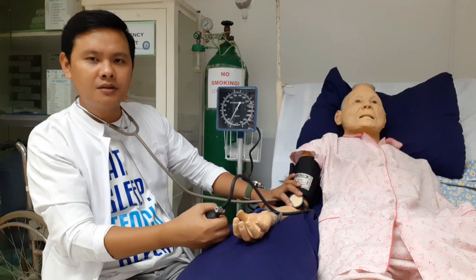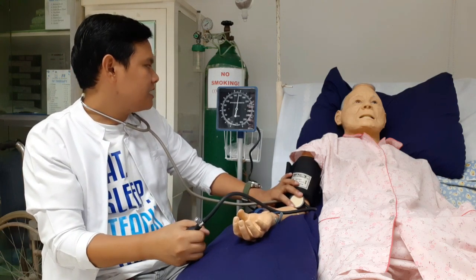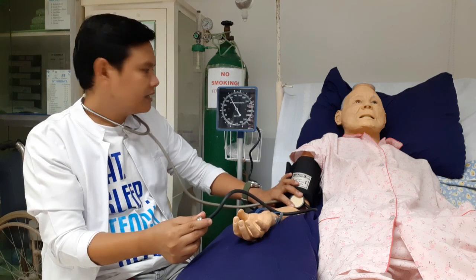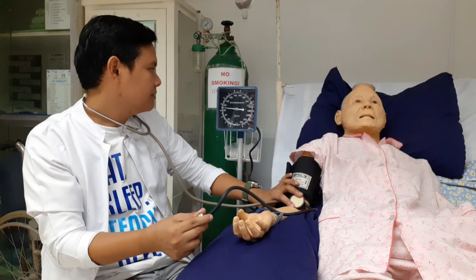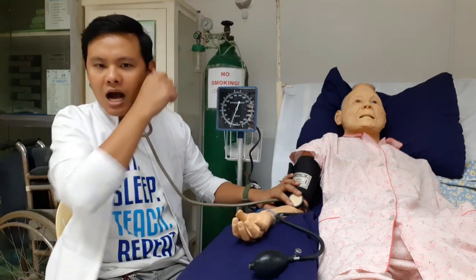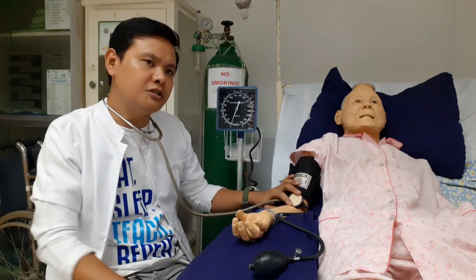Tingnan natin ulit, sa may inflate ko hanggang 150. And then, dahan-dahan natin ibaba. Dahan-dahan lang dapat, around 2 to 3 mm of mercury per second. Okay. So, paano natin malalaman? How will we be able to check or identify kung ano yung pressure ng pasyente?